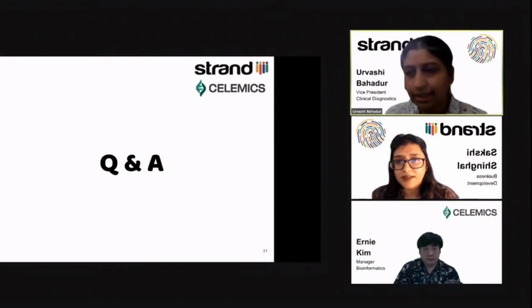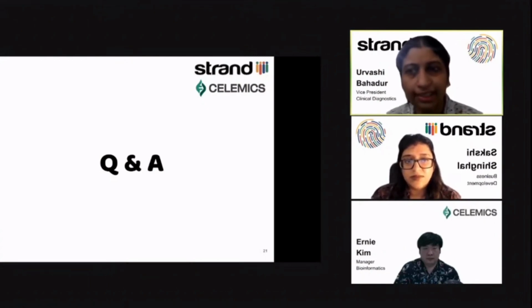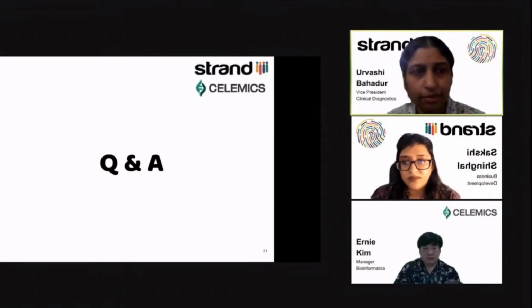Right. So StrandOmics does that. I think we've built our own. StrandOmics is the software which takes into account various databases plus a curated knowledge base and assigns this label. So it's our own software that we use. It's not just a software for creating a report.